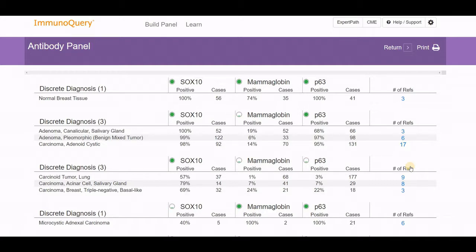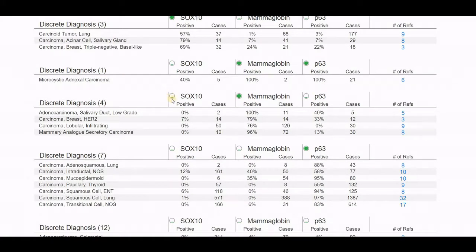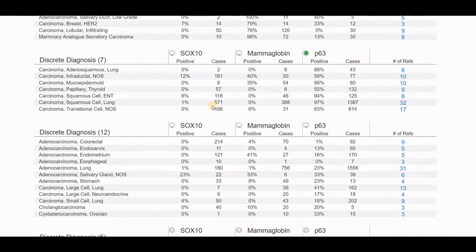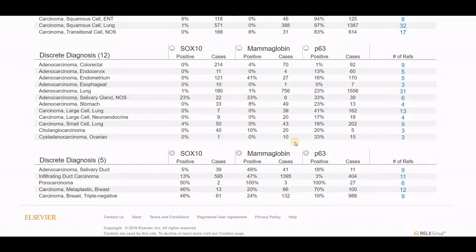In this setting, you'll have diagnoses that may or may not express these particular markers to some degree. This allows you to look at what panel helps you come up with an accurate diagnosis. You'll see pleomorphic adenoma, but only 6% of cases have mammoglobin positive. Normal breast tissue is present. As you go through, you'll notice the radio buttons are filled in to say a positive result will be meaningful, where if it has very small green, it may not be useful. When filled with grayed out area, it's not going to separate between these categories in any meaningful fashion. If you're looking at infiltrating ductal carcinoma, these markers won't be of value.